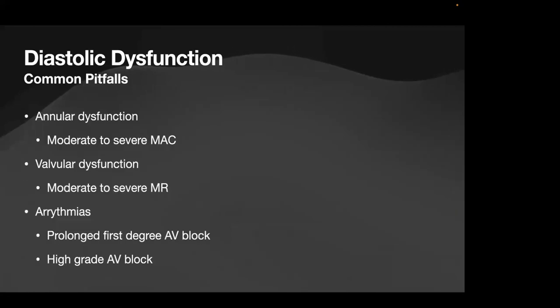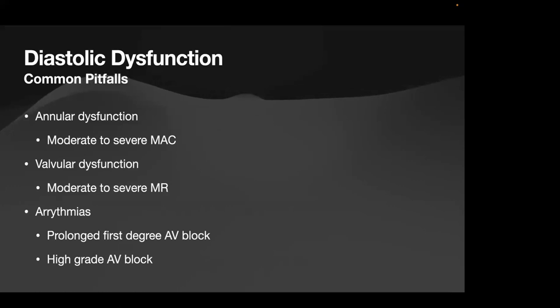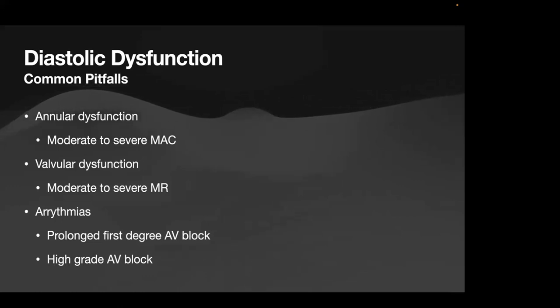Okay. And thankfully, this is not a big talk, because diastology is a difficult talk to talk about. But these are a couple of the pitfalls that you could think about when you're measuring someone's diastolic function. And again, there's a lot of caveats. This is not an exhaustive list. But these are the things that we see very regularly, which are going to hinder our assessment of diastolic function.